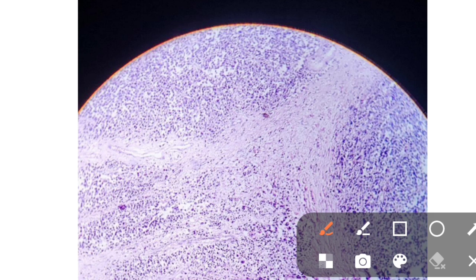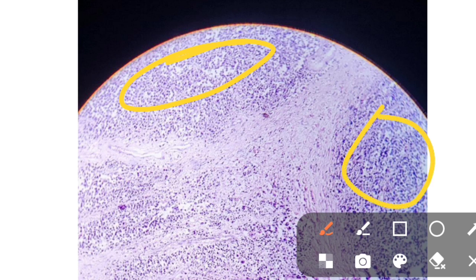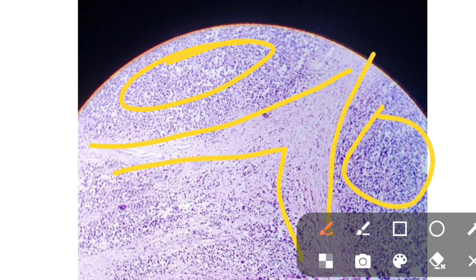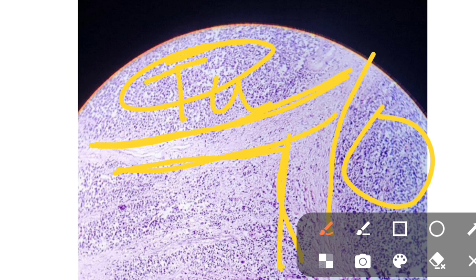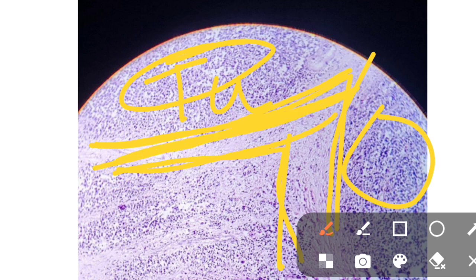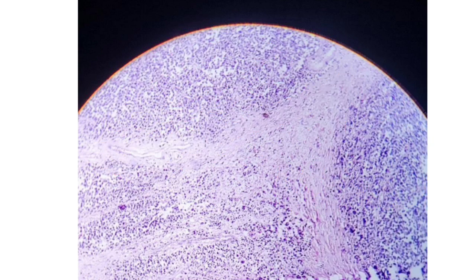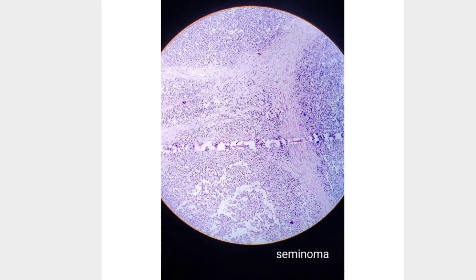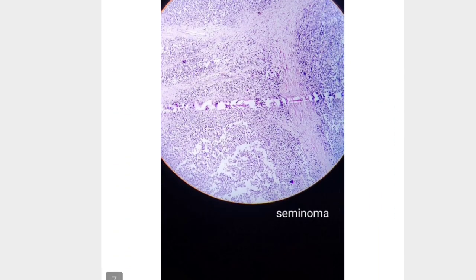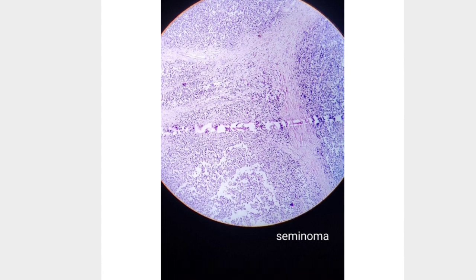The seminoma cells or tumor cells are arranged in lobules separated by a fibrovascular stroma. Seminoma has two components: the tumor cells and the surrounding stroma, with lymphocytic infiltration present in the stroma. This is seminoma, the most common tumor of the testis.